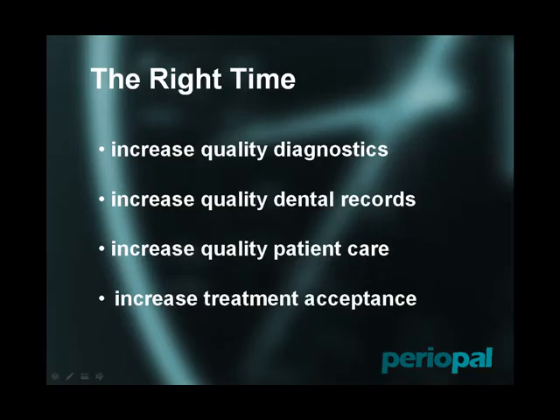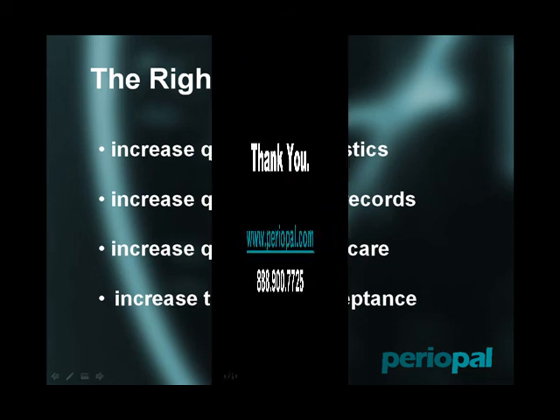The time is now for voice-activated exams. PerioPal is not the first voice-driven periodontal exam, but it may be the first that is truly usable. Charting usability and excellence is the base standard from which we seek to improve.